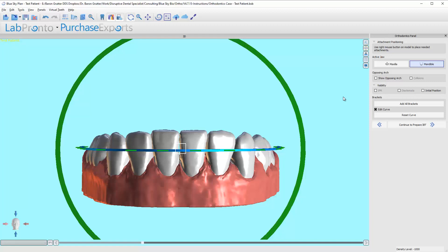We will add them eventually. I find personally that indirect bonding for molar brackets is difficult because the trays have to extend so far back that it can be tricky. It's becoming easier, so I think we'll add that soon. It just hasn't been added as of this video.